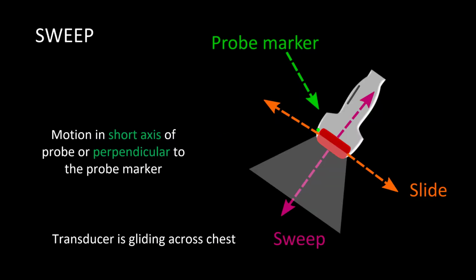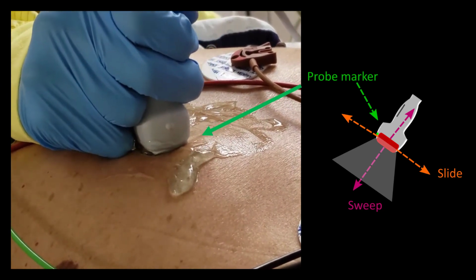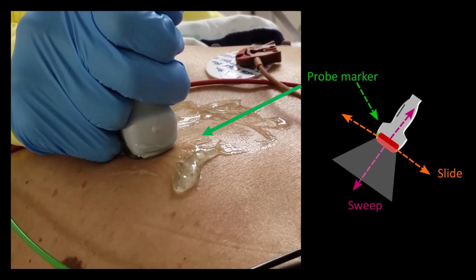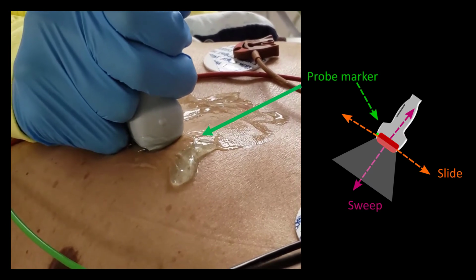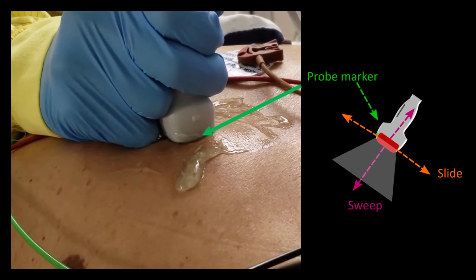To sweep is the second motion, and to sweep the probe refers to the lateral translation of the beam in the short axis of the probe. The probe is held in the same upright position, but is moved across the skin perpendicular to the index marker, or probe marker. This is a live example of the motion associated with sweeping. The movement is orthogonal to the axis of the beam and to the probe marker. This is essentially the opposite movement to sliding.